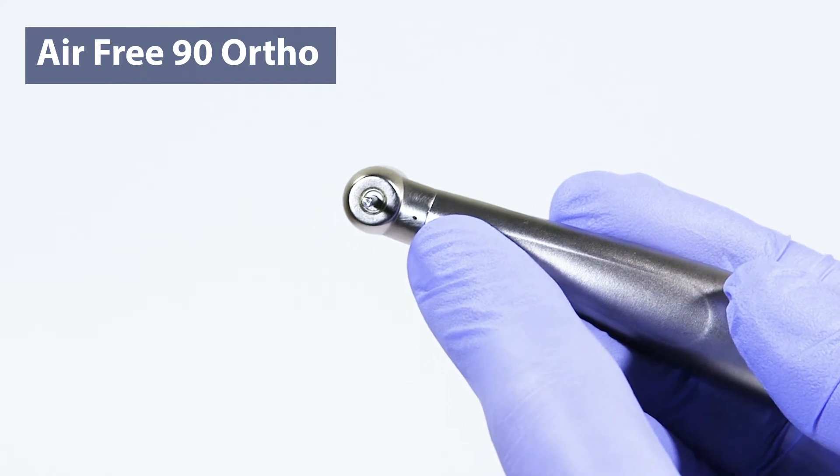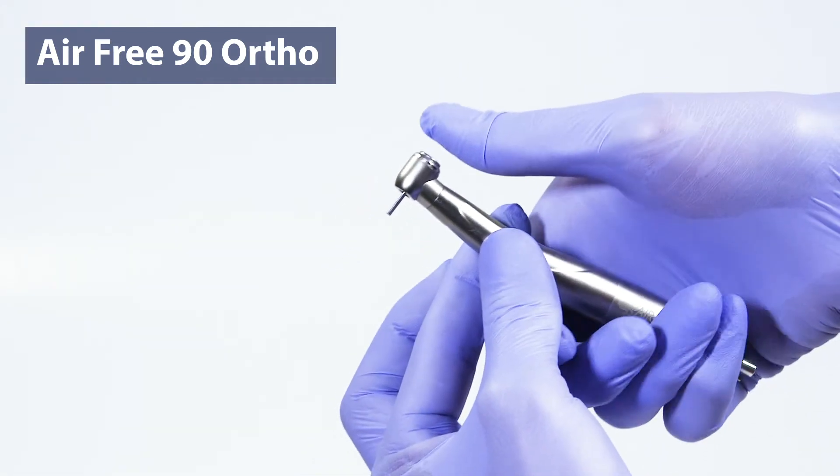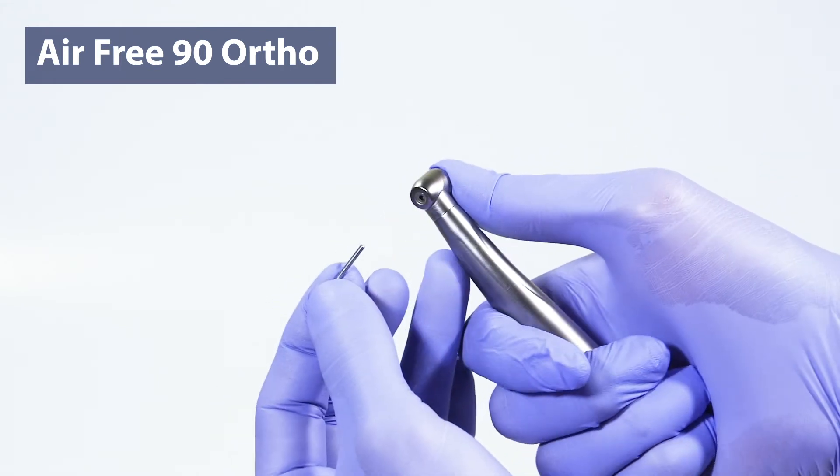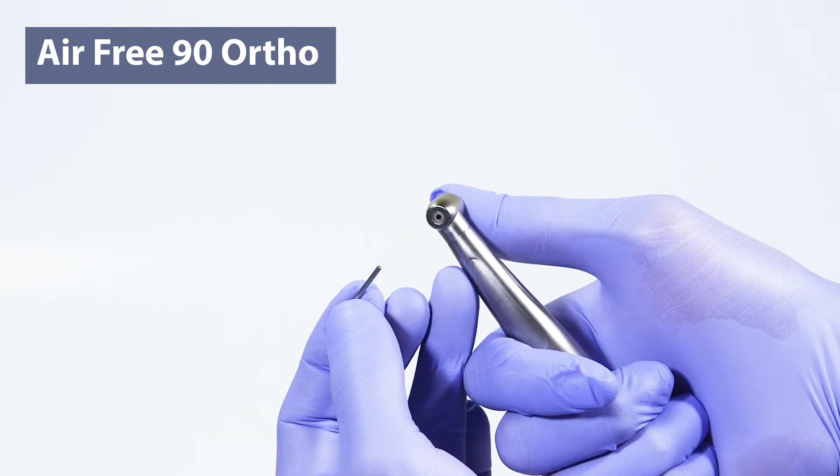It is equipped with a push-button chuck for a one-touch burr insertion and removal. This chucking system also boasts a 10-pound retention force for patient safety.